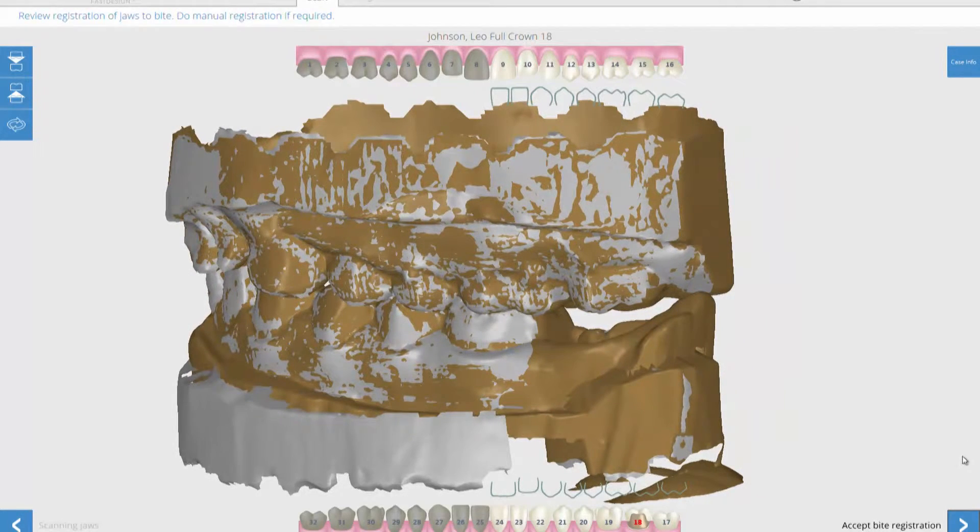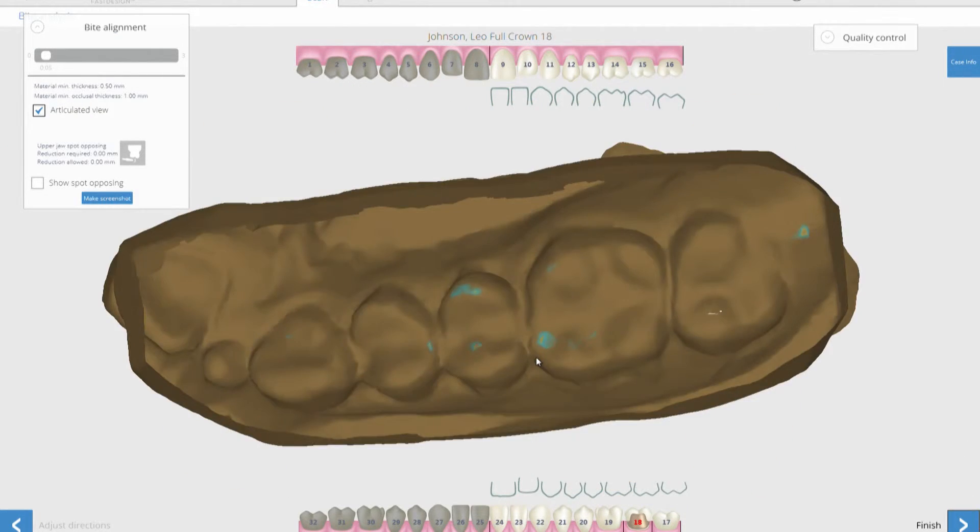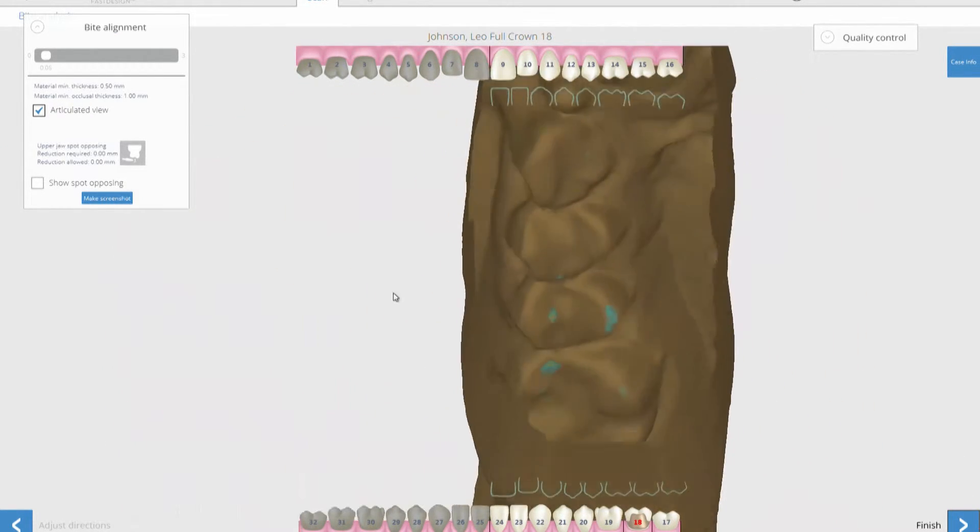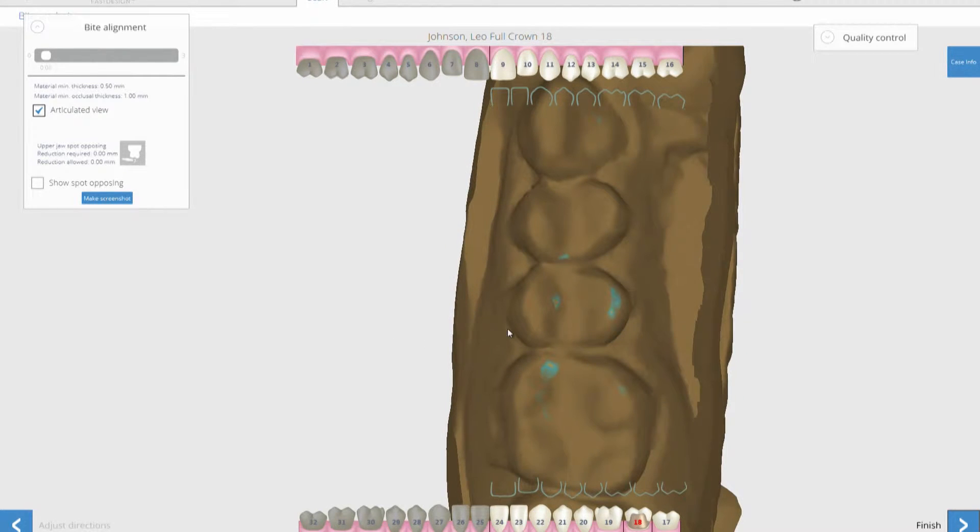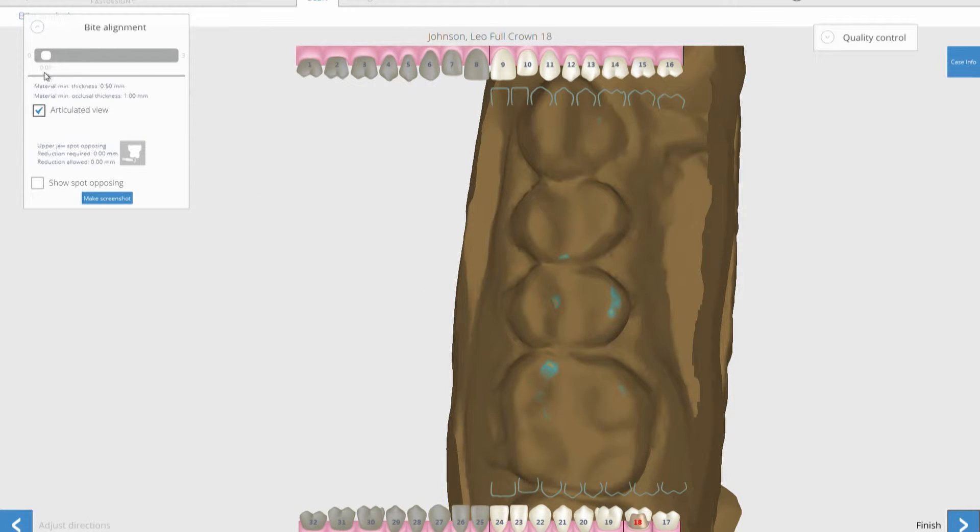The software includes visual indicators that allow you to quickly verify the centric contact points. You can also see that there is an indicator of how much occlusal clearance there is. The scanning process is just that quick.